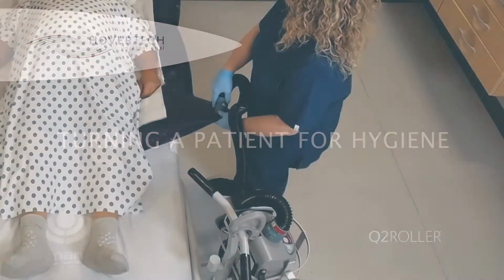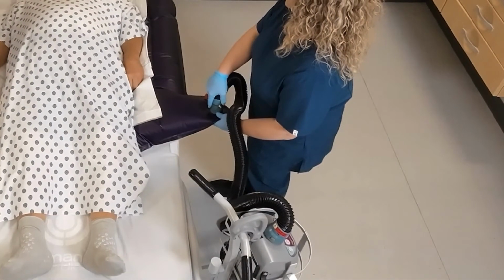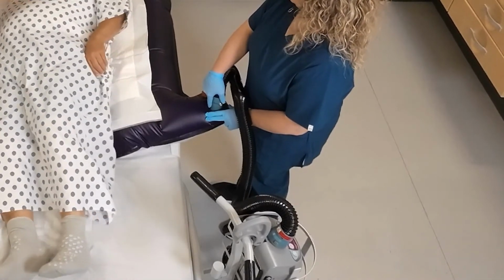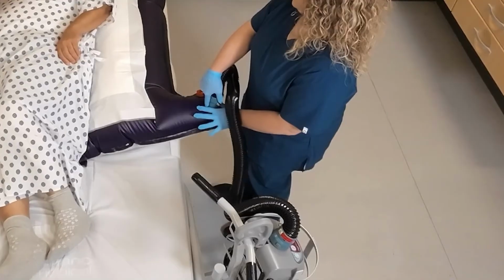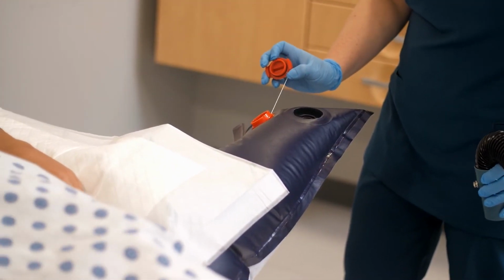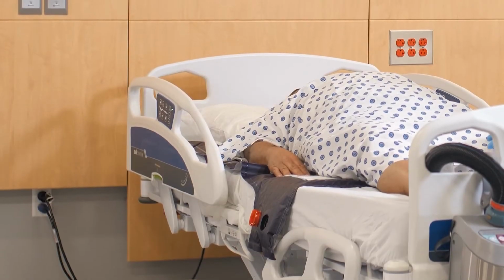To fully turn a patient for hygiene or perineal check, fully inflate a single chamber. This will completely turn the patient on their side. While turned, stabilize the patient and deflate the chamber to expose the area. After complete, return the patient to a supine position.